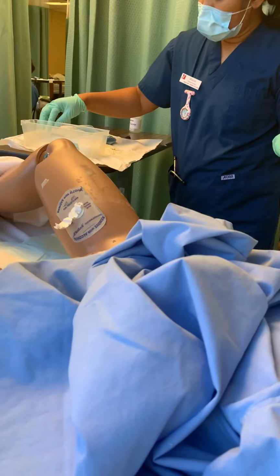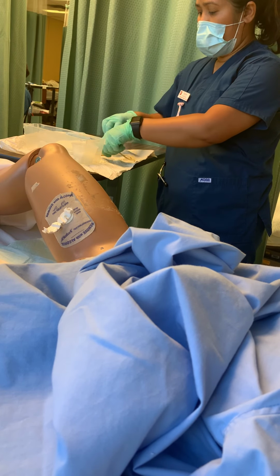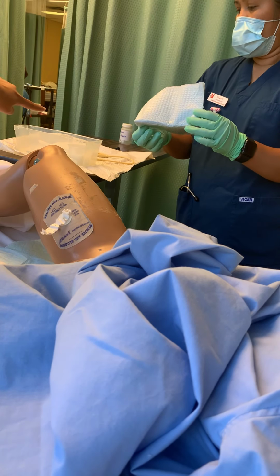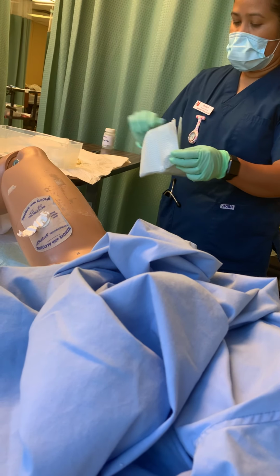On this one, I have to lubricate my catheter. First, you can put the drapes on, because my hand is going to get dirty and I'll make it dirty later. So drape. And make sure you don't put the catheter on the two sides, because 1 inch is considered the border. Put it in the middle to be sure.